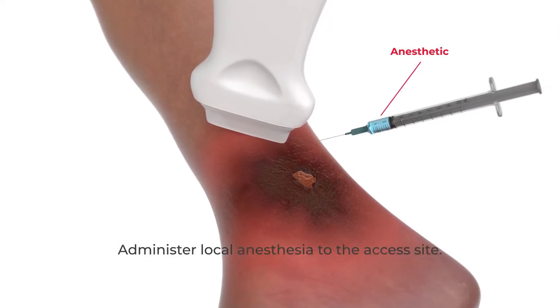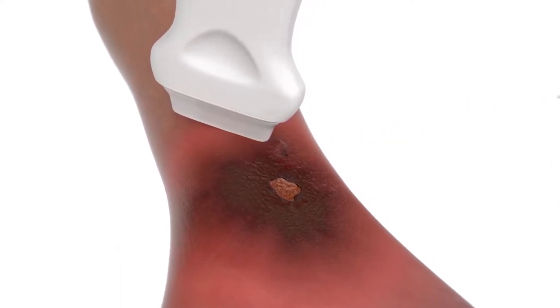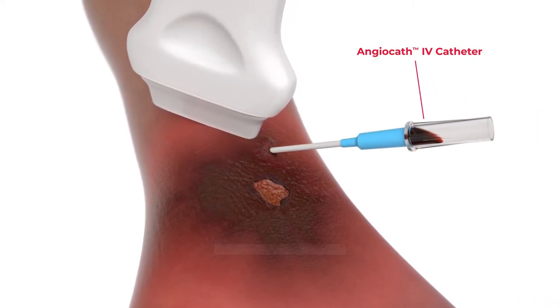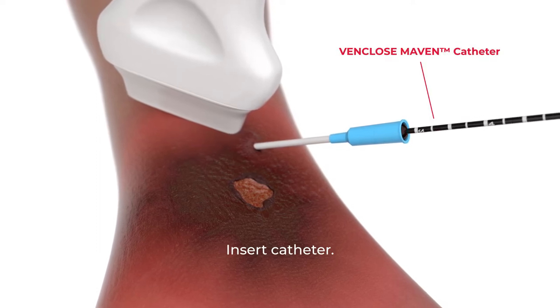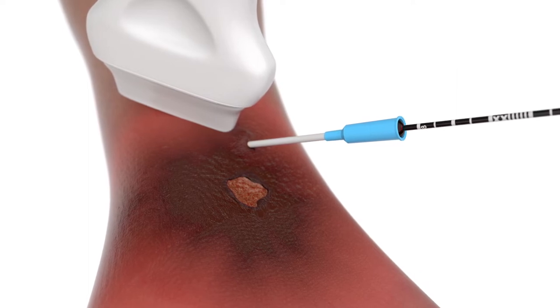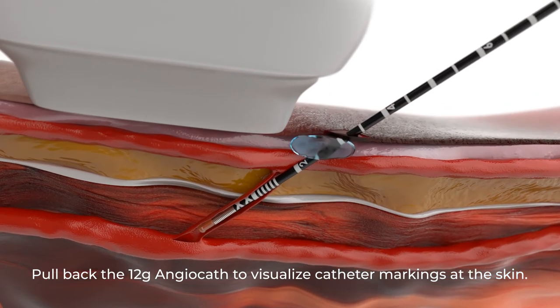Administer local anesthesia to the access site. Make a skin nick, then insert the 12-gauge angiocath until flashback appears and confirm position with ultrasound. Remove the needle from the 12-gauge angiocath. Insert the VenCloseMaven catheter and advance the tip to the desired treatment start location under direct ultrasound visualization to ensure that the catheter is positioned appropriately. Pull back the 12-gauge angiocath to visualize catheter markings at the skin.